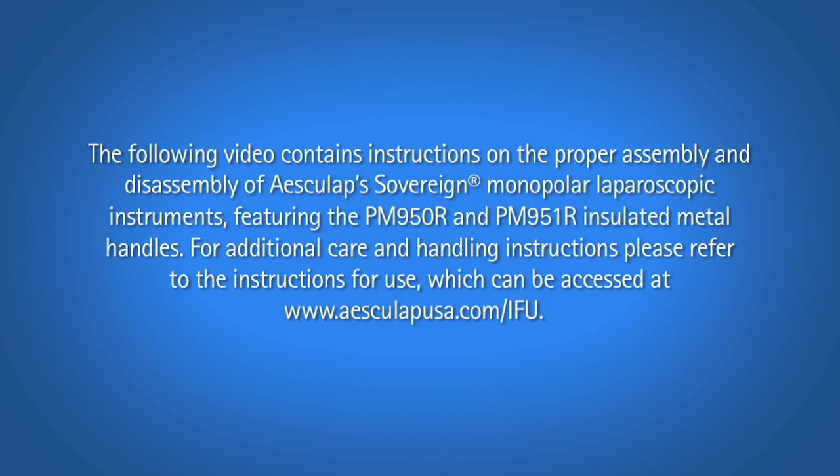The following video contains instructions on the proper assembly and disassembly of Aesculap's Sovereign monopolar laparoscopic instruments featuring the PM950R and PM951R insulated metal handles. For additional care and handling instructions, please refer to the instructions for use, which can be accessed at www.aesculapusa.com/IFU.